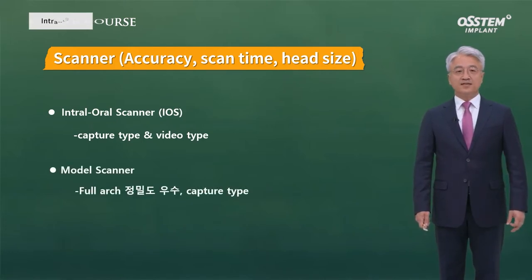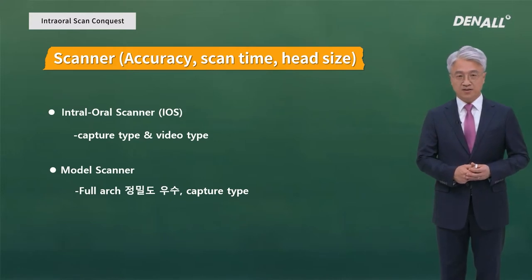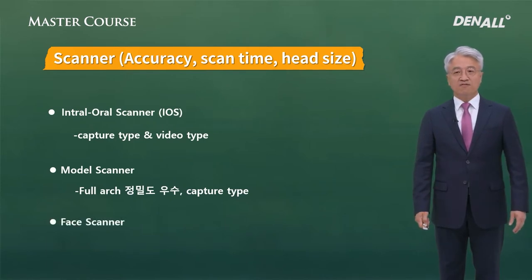In the case of full mouth cases, if you use intraoral scanners, a lot of error can occur. In order to reduce such error, if you use model scans, it could help in increasing accuracy. A lot of effort is being put into facial scanners as well, and I use it frequently in my dental clinic.